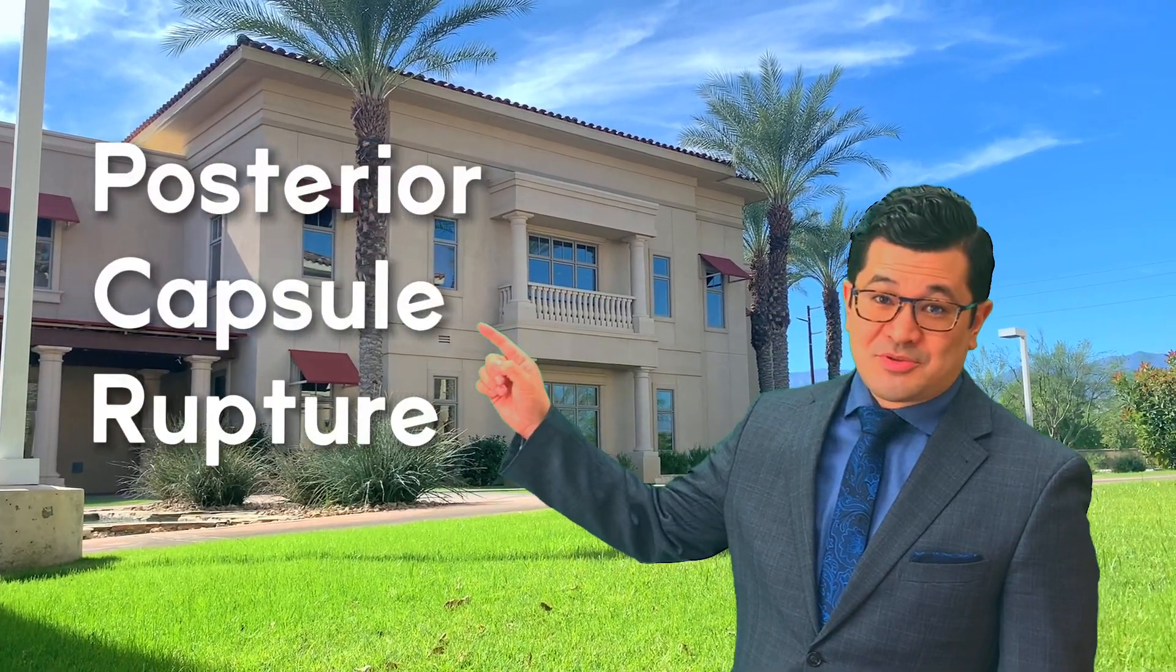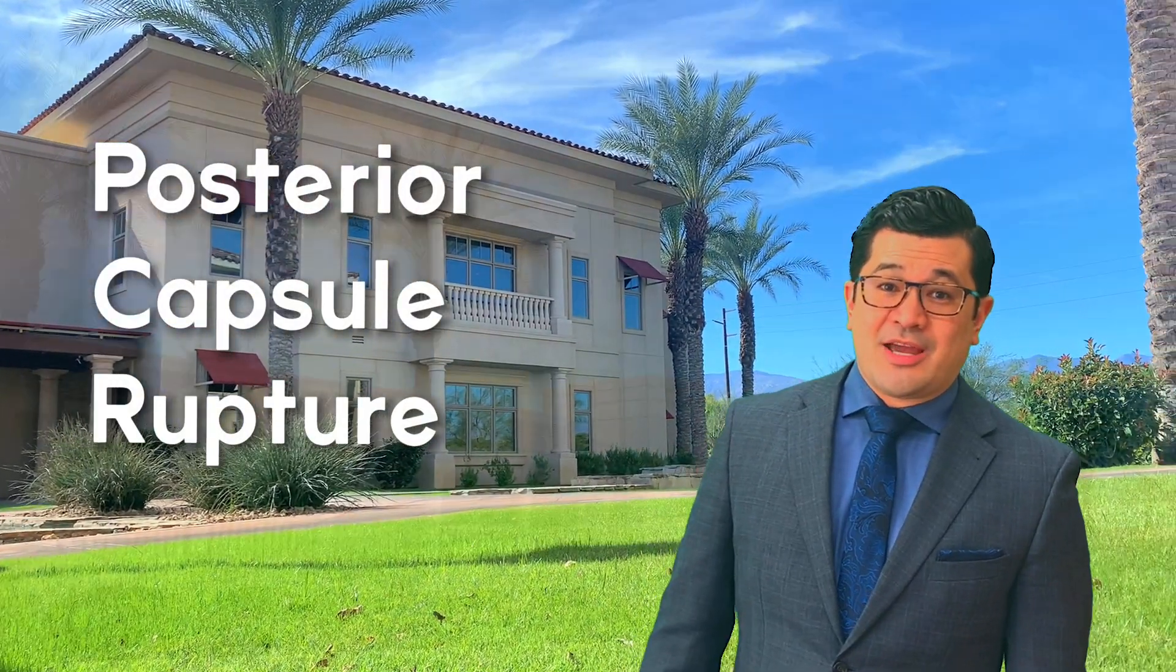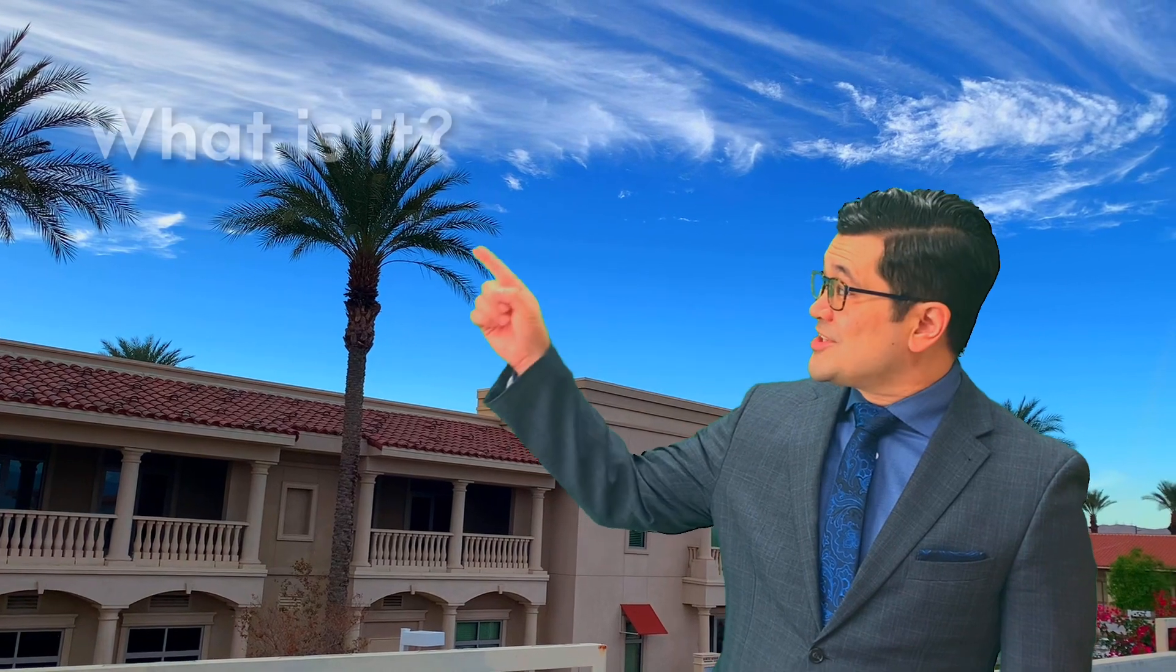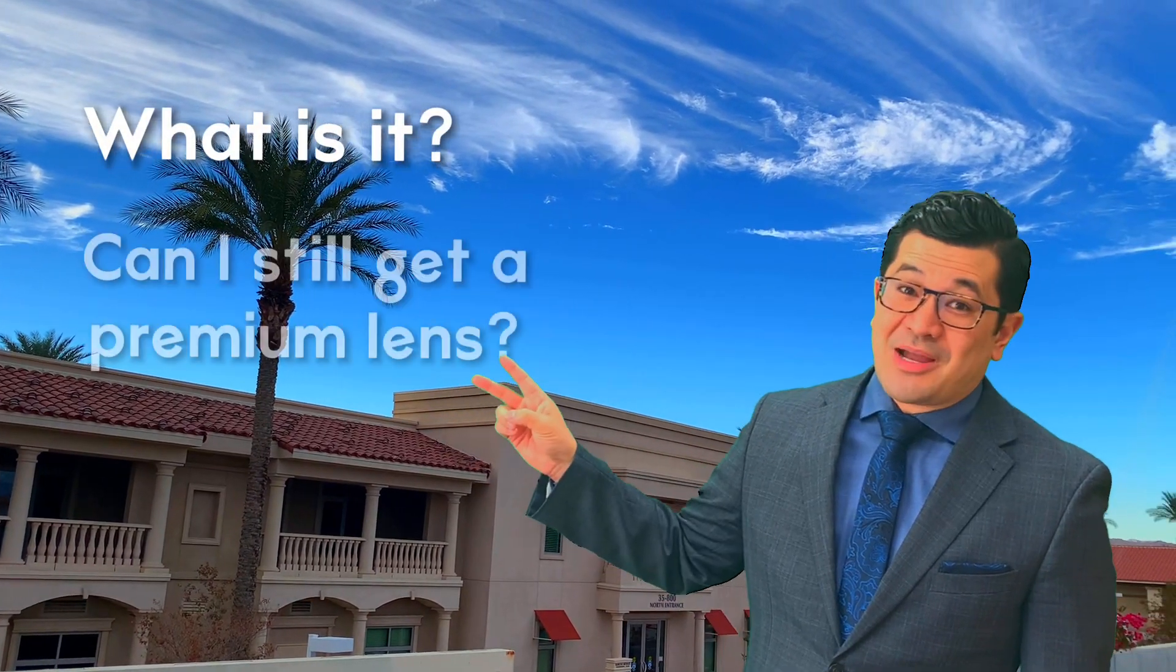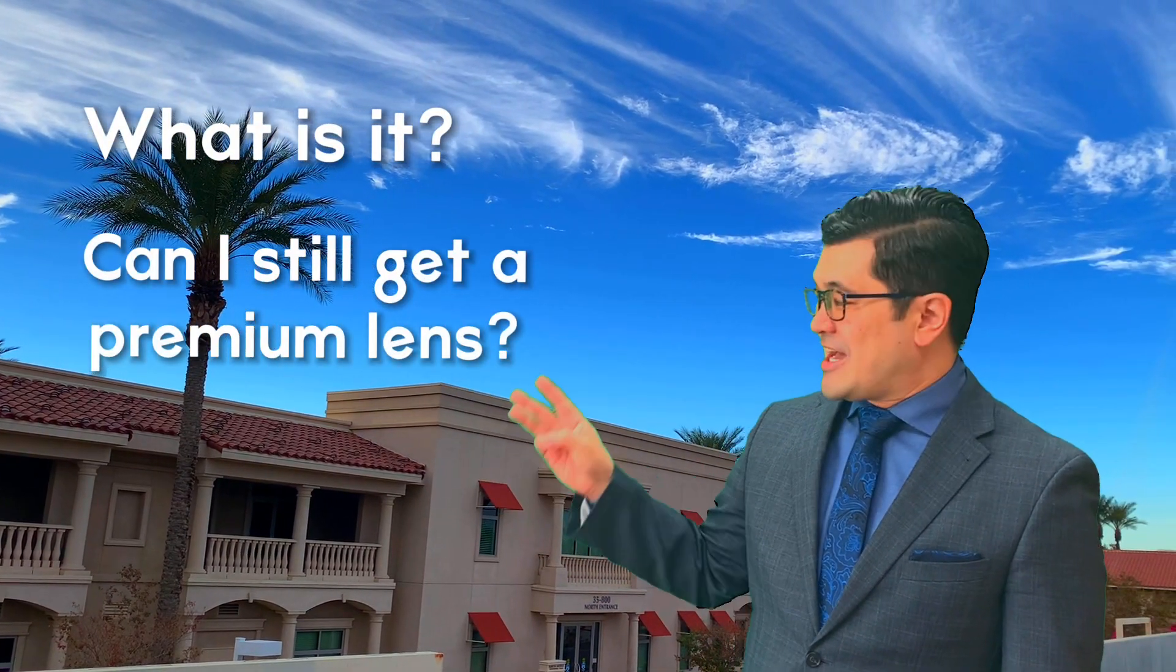In this episode of botched cataract surgery, we're going to be covering posterior capsule rupture. Specifically, we're going to answer three questions: what is it, can I still get my premium lens implant, and how is it managed?